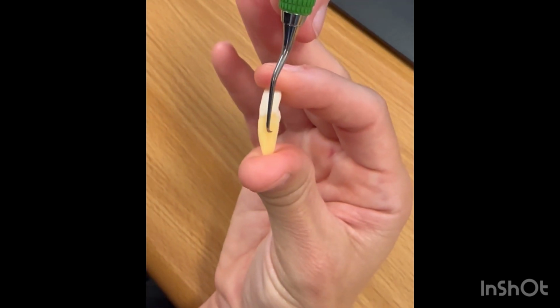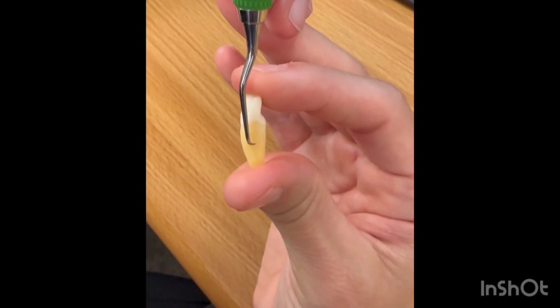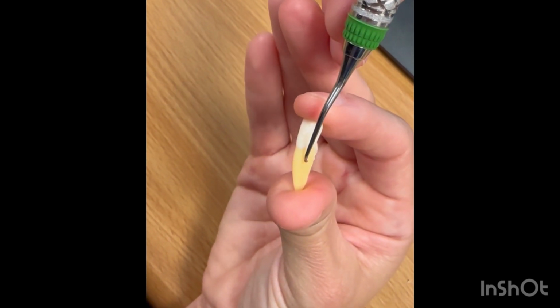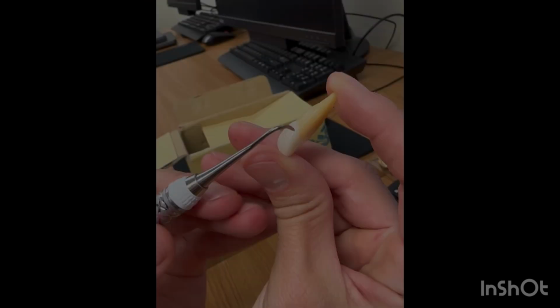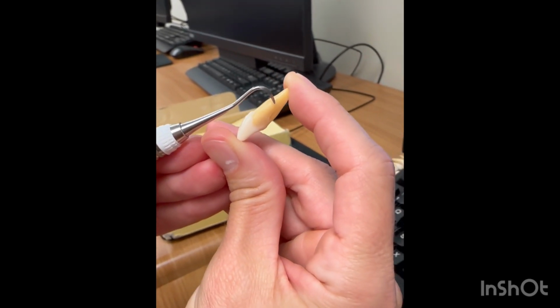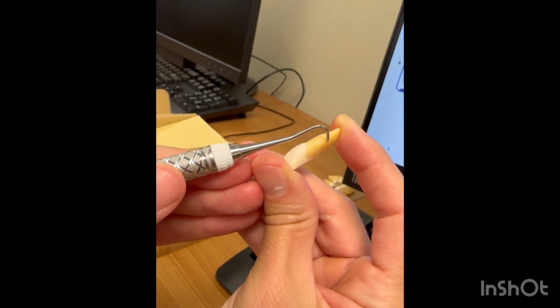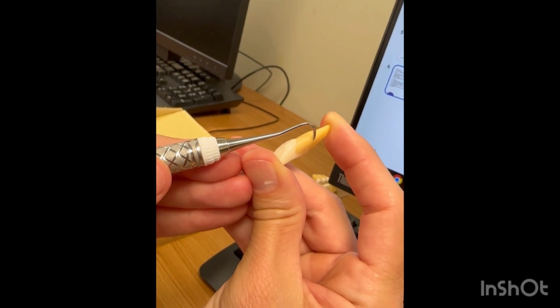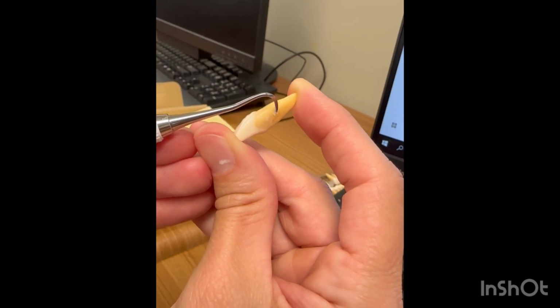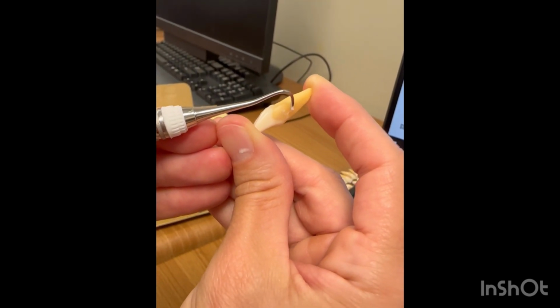Here Janelle is showing adaptation of the 5/6 mini. The goal is to keep the toe third of the blade on the tooth throughout scaling to ensure proper adaptation. Here we wanted to demonstrate what adapting with the 7/8 sickle would look like. It's important to remember that the correct angulation we're looking for is about 45 to 90 degrees to maintain adaptation.